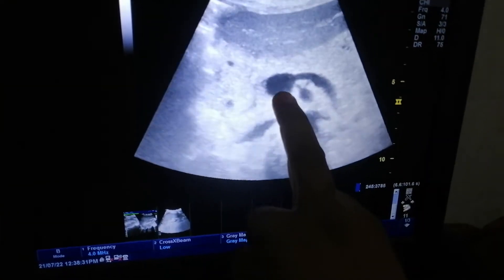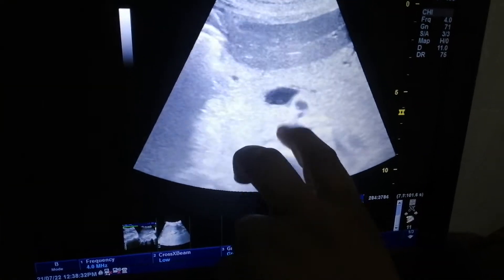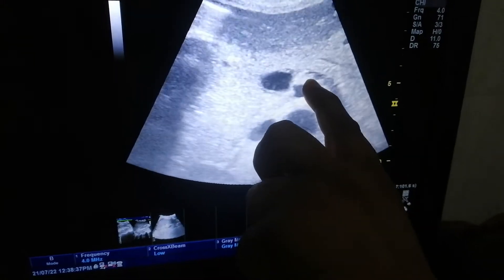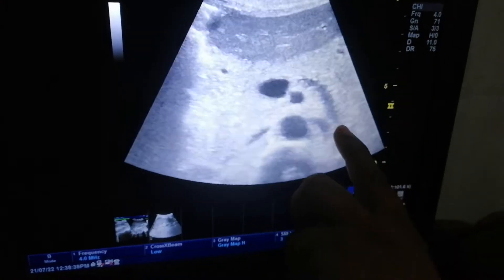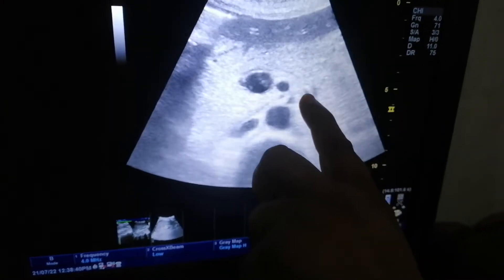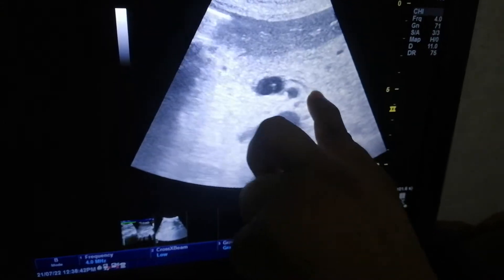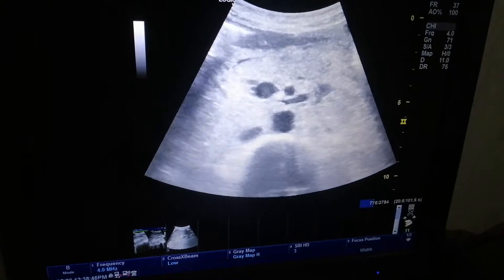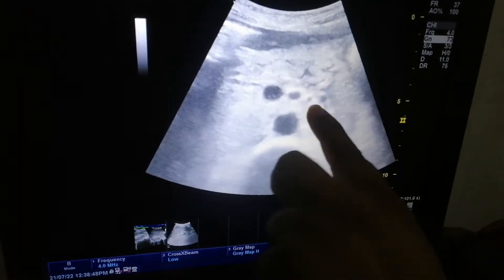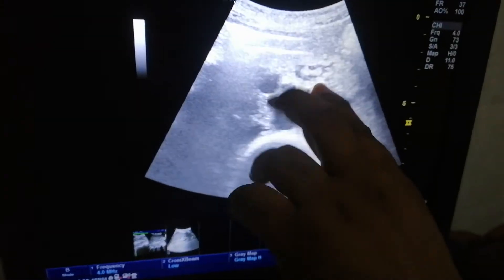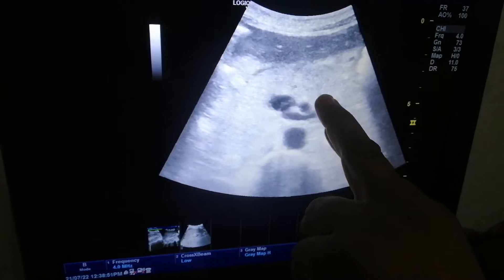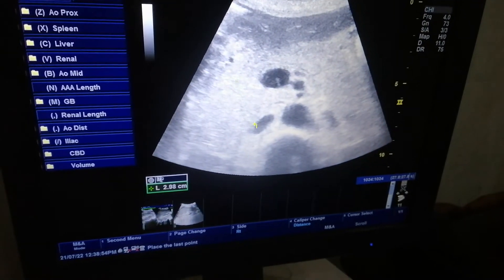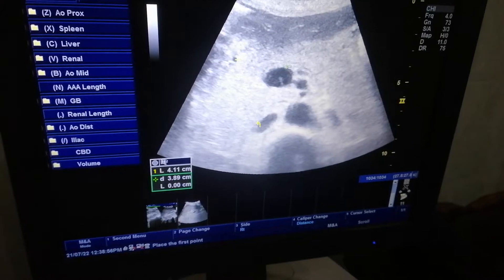This case is showing the pancreas. We can see there is a streak of fluid around the porto-splenic confluence. There is an edematous pancreas, and the sizes of the pancreas are also enlarged.